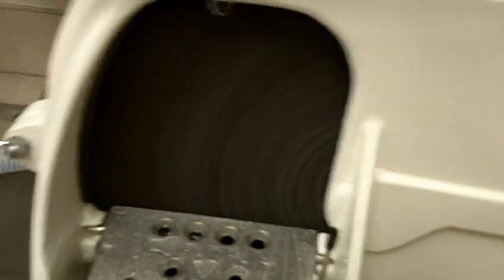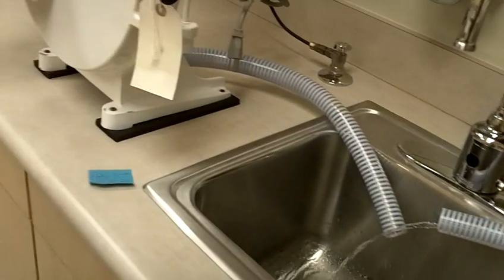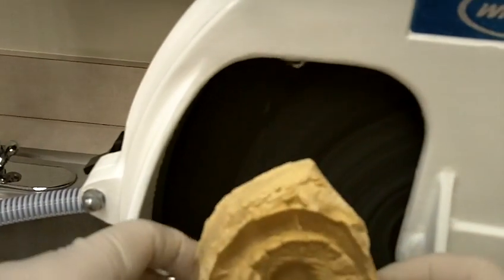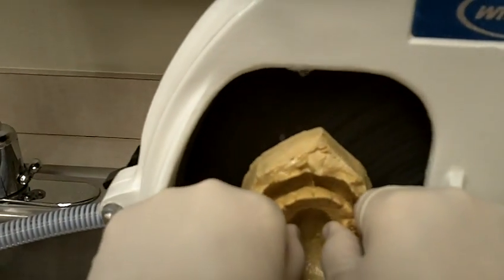Okay, so we now have on our machine, we've already regulated the water. We're going to get our model. The first thing we're going to do is take our anterior one. We're going to start with the top one. We're going to smooth out the base.